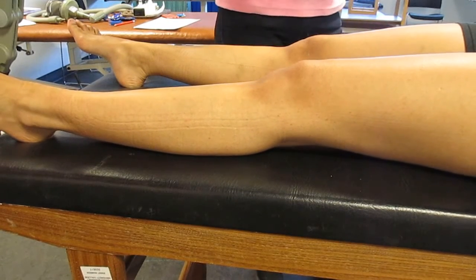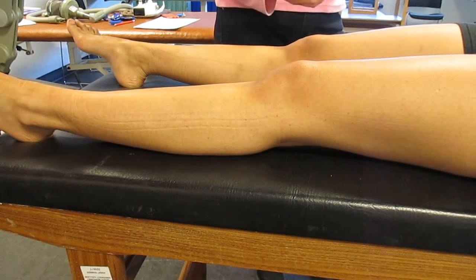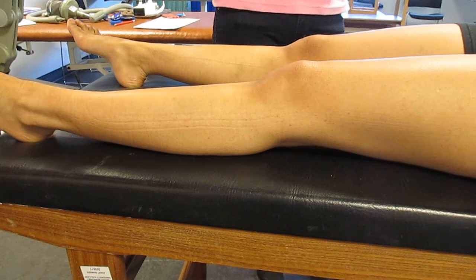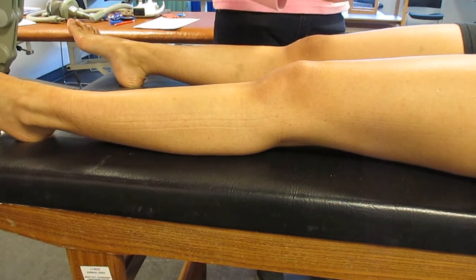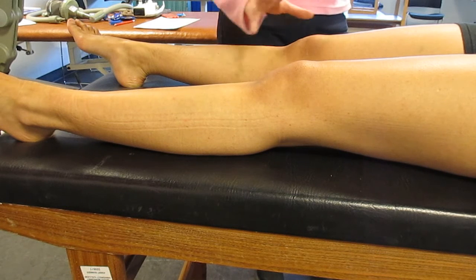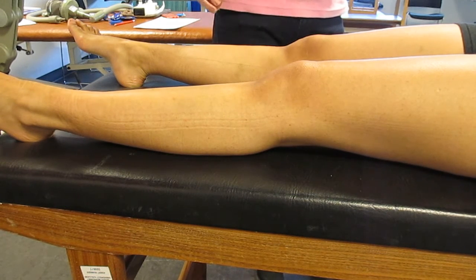I'm going to demonstrate doing pulsed shortwave therapy now. Prior to doing the treatment, you need to check that your patient doesn't have any contraindications, that you've got the part of the body suitably exposed or clothing removed and any jewellery and metal from the area removed. You also, just for safety's sake, it would be better if you're on a wooden plinth, although when it's pulsed it's not as important.